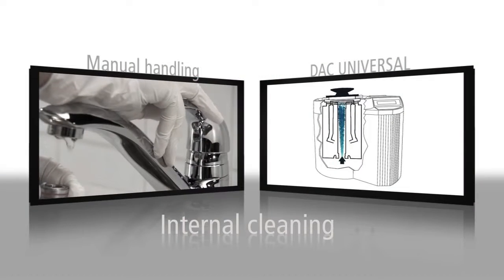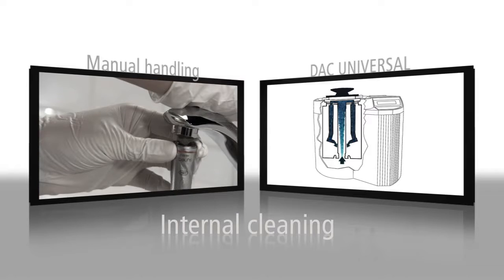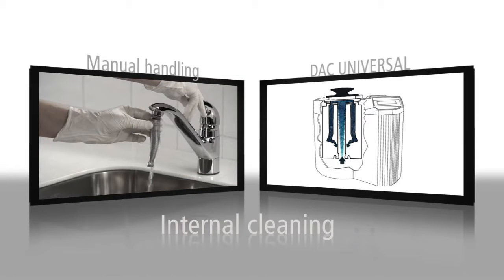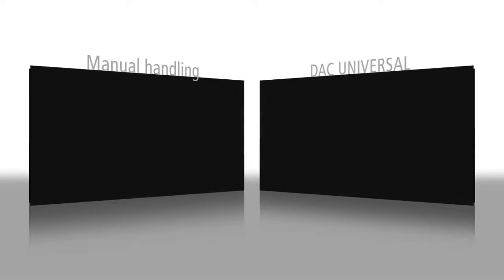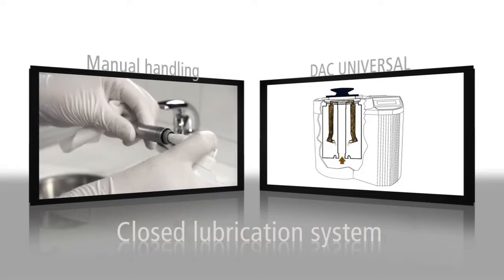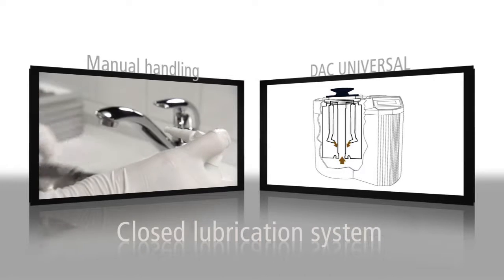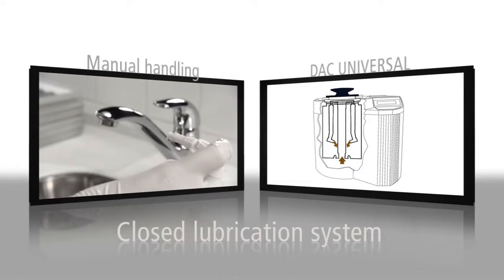To ensure the highest level of instrument hygiene, the DAC Universal's internal cleaning procedure automatically removes BioBurden from the instrument's inner channels, which are not accessible through manual cleaning. The instruments are then lubricated with an identically dosed amount of oil through the closed lubrication system of the autoclave. This also means that no unpleasant oil fumes are released into the sterilization room.